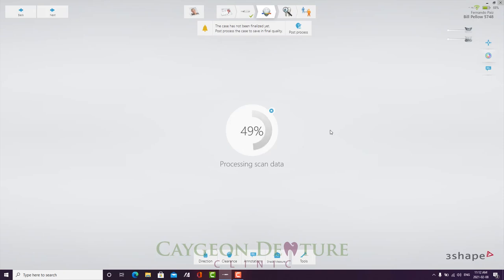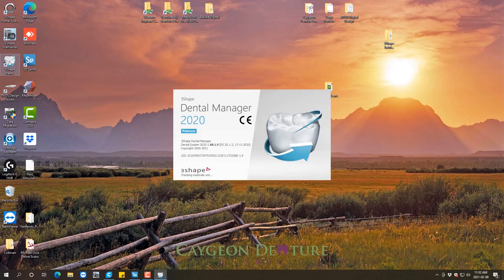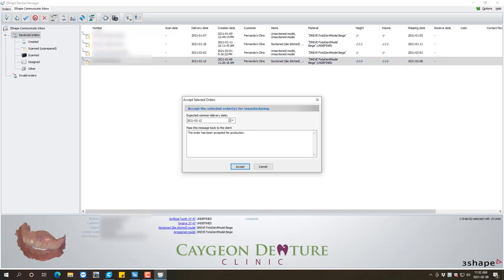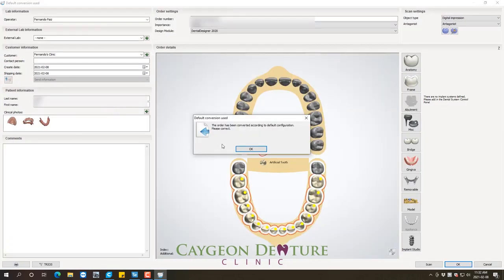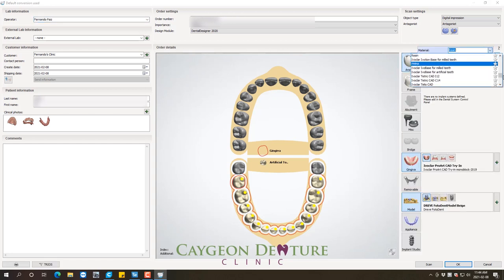After the post-processing is done with the Trios software, I'm able to transfer all the information over using 3Shape Communicate to my Dental System. At this point, I can create an order to fabricate the complete lower denture. I use the Ivoclar digital denture workflow to create all my dentures, partials and complete. And in this case, you can see that I am going to be doing a monoblock try-in for that complete lower denture.